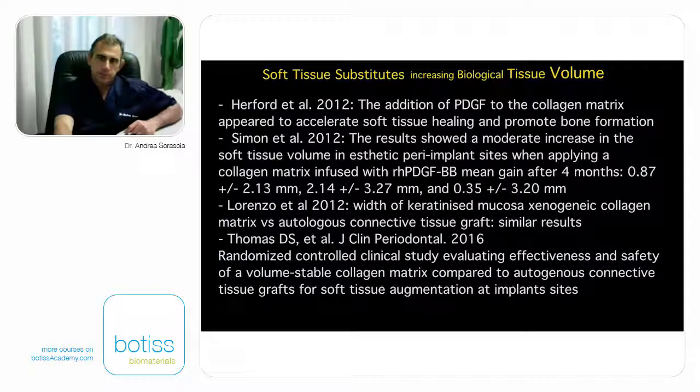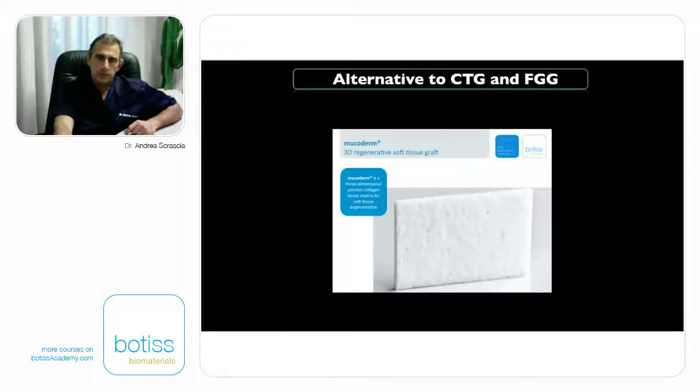So, an alternative to the connective tissue graft and free gingival graft that I have been using is Mucoderm porcine collagen tissue matrix.